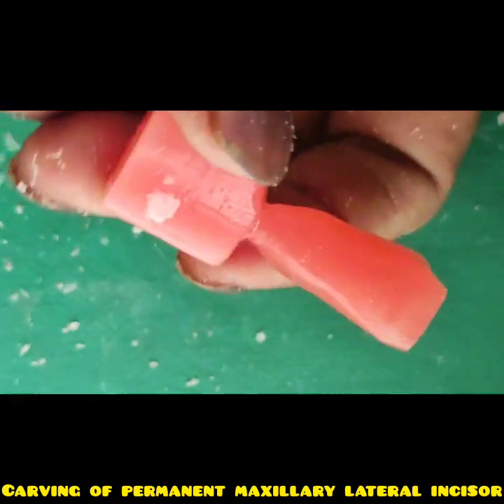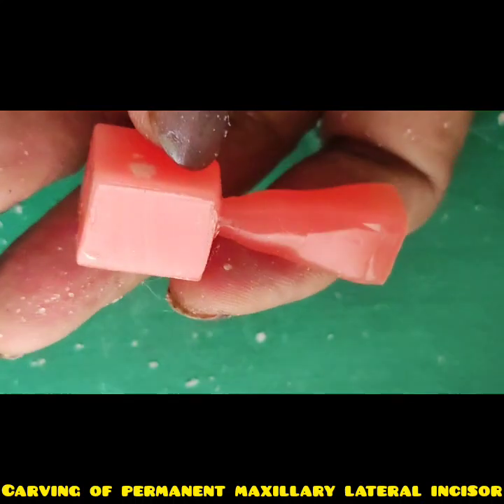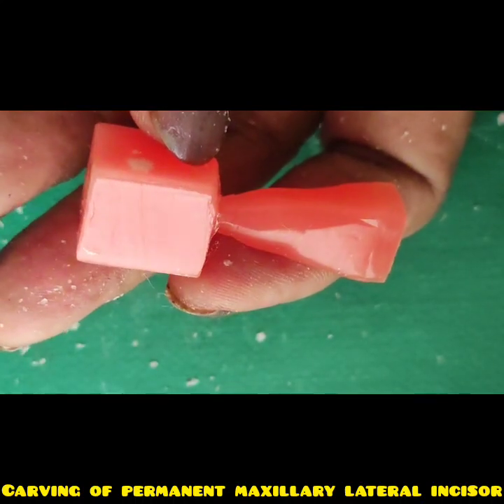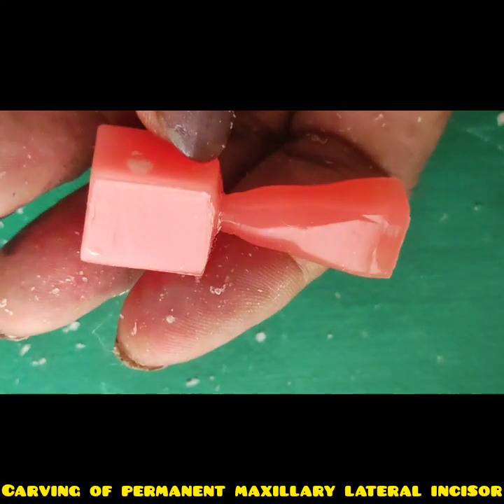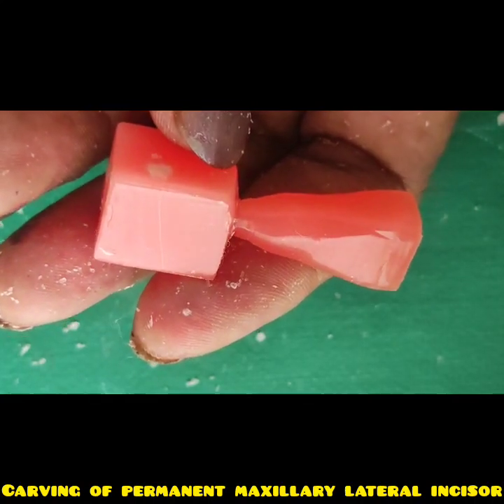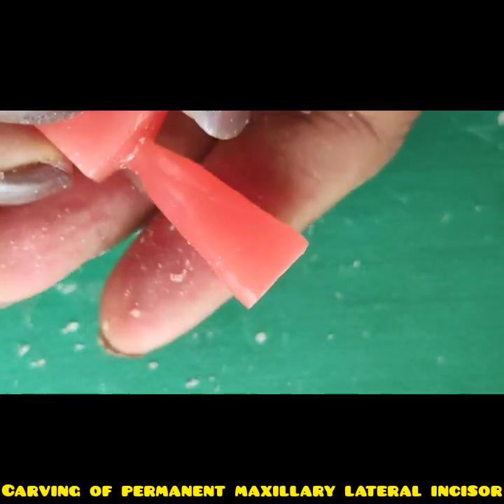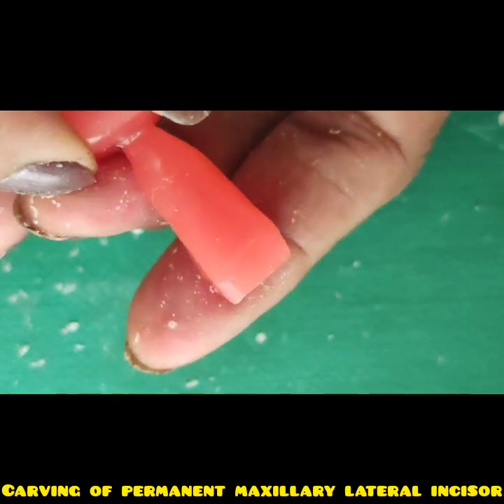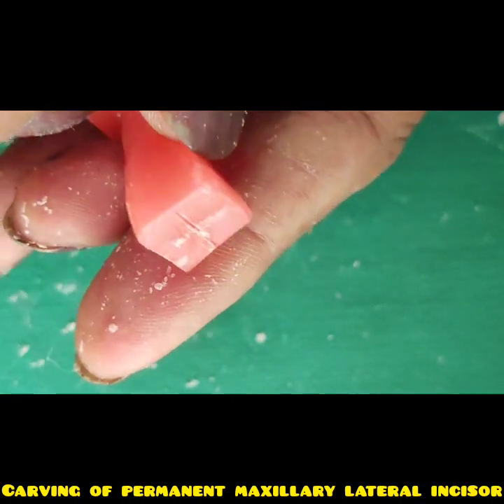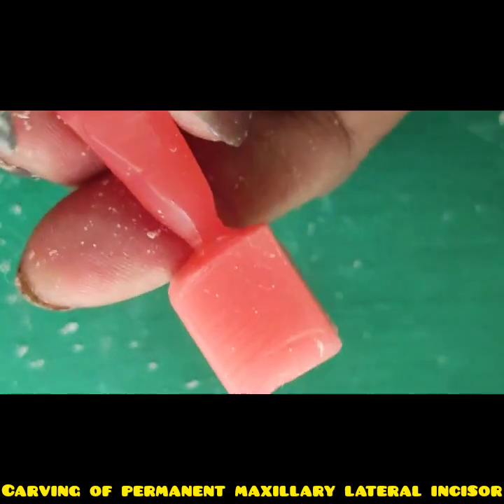Now for this carving I have already done the root part to save time, and if you want to know the details of root carving from the first step, you can follow the central incisor carving. Okay, so the maxillary lateral incisor is a little smaller than the maxillary central, and I will do the crown and show you the differences between the crown of the maxillary central and lateral.